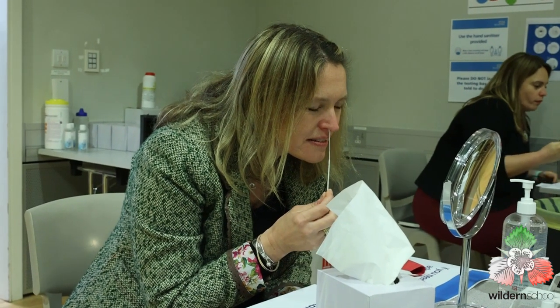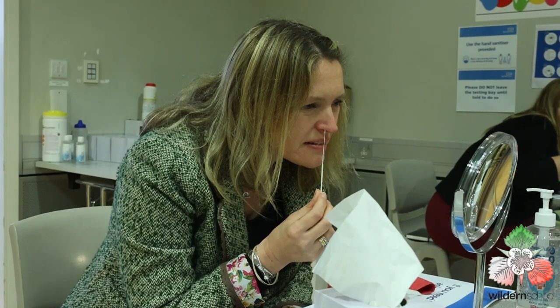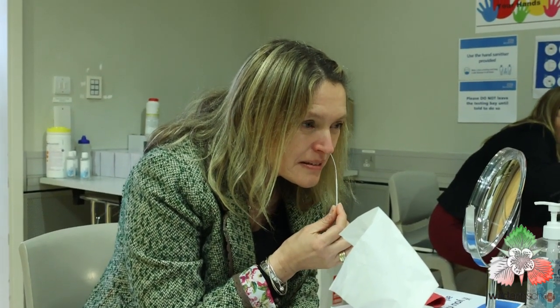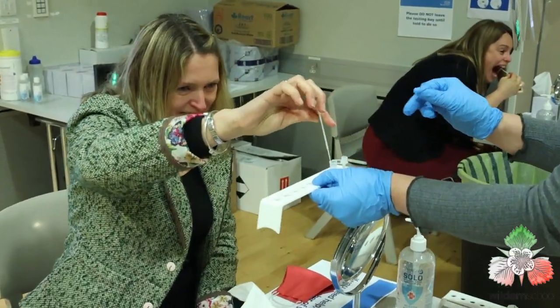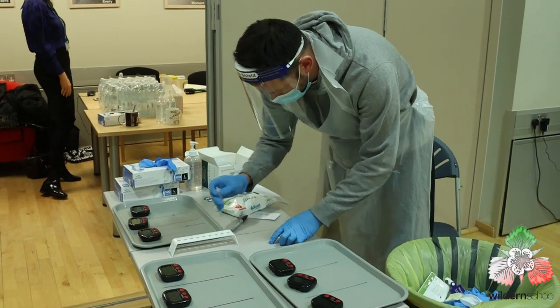Using the same swab, you will then gently put the fabric end into a nostril until you feel a slight resistance. You will need to roll the swab 5 times slowly along the inside of the nostril. If you are unable to, or if you feel uncomfortable about swabbing the back of your throat, please don't worry. Instead, you can take a swab from both of your nostrils instead. After this step, you will then be asked to pass the swab back to the test administrator at your station. Your test will then be passed to someone who will process your test.